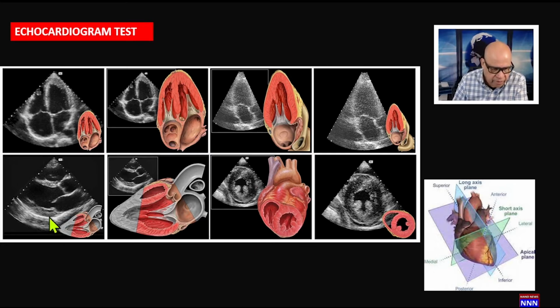So if you have a pericardial effusion, it should stop somewhere here at the coronary sinus, whereas pleural effusion can go beyond the pericardial shadow above the coronary sinus. So those are some finer points. And here we have the left atrium.